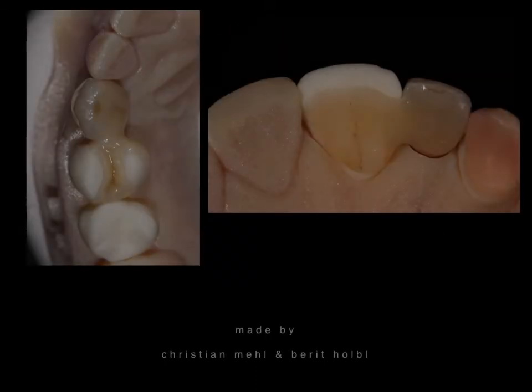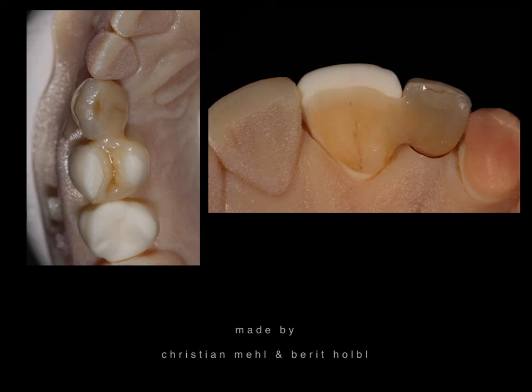You can see here the bridges in close-up. The bridge on the left side I have to classify as an experimental treatment. For lateral and posterior teeth, there is not a lot of scientific data available, so these have to be done with caution. However, we haven't had a single bridge fail in 15 years, and patients have been extremely happy with this procedure — they didn't need an implant or a conventional bridge that means drilling down neighboring teeth.